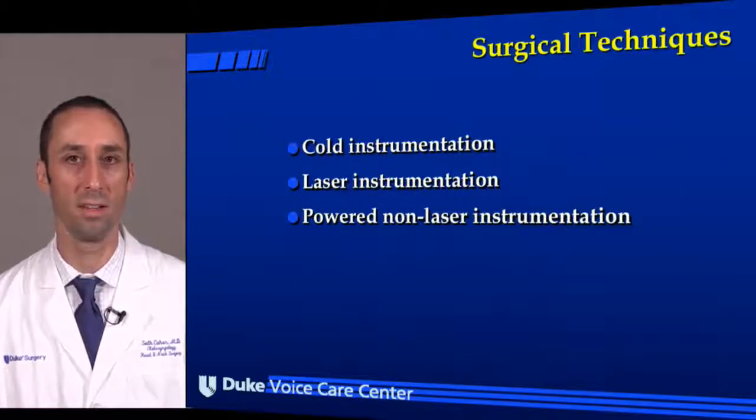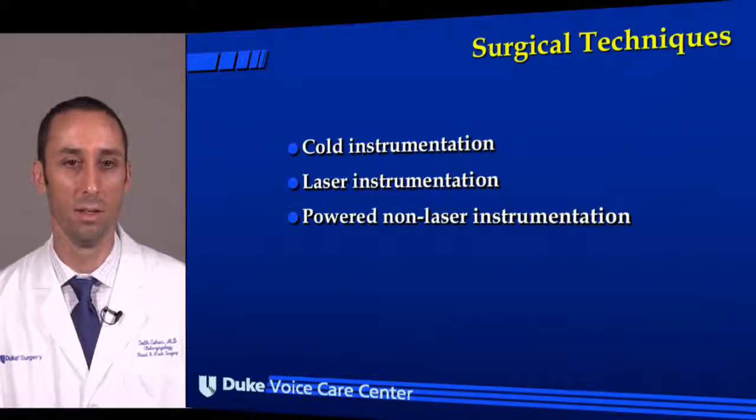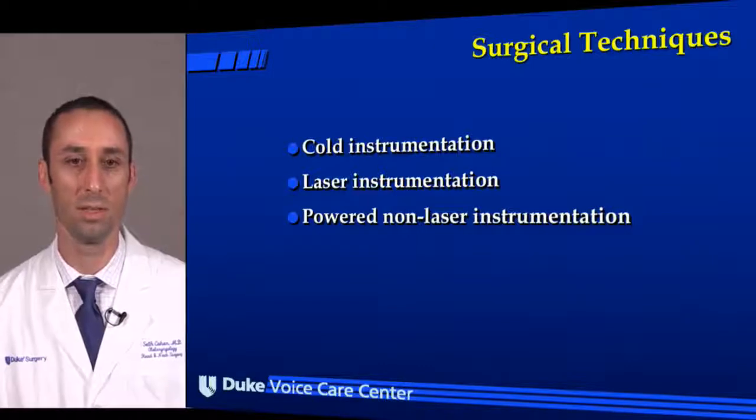There are various techniques that can be used, and we're going to go over some of these. Cold instrumentation, laser instrumentation, and there's also powered non-laser instrumentation.